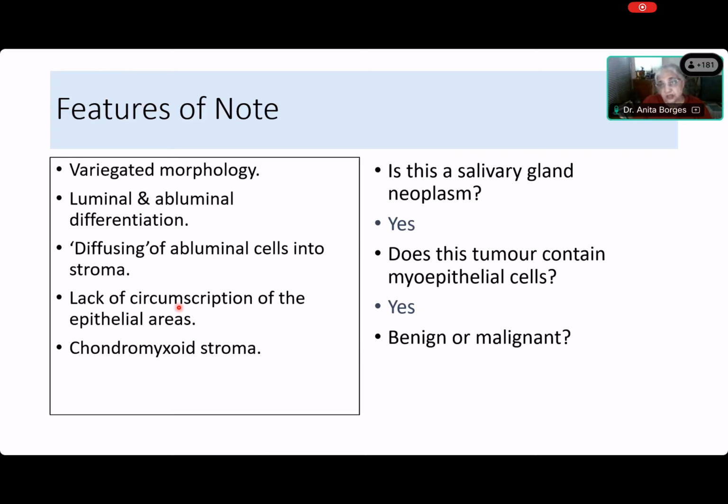So please, Shivani, this is not the way that you just answer anything because you're asked a question. All right. So yes, this is a benign mixed tumor, and don't pat yourself on the back, Shivani, and say, "Oh, I made the right diagnosis." You made the right diagnosis by matching pictures. You didn't do a systematic analysis of why this is a mixed tumor or a pleomorphic adenoma.